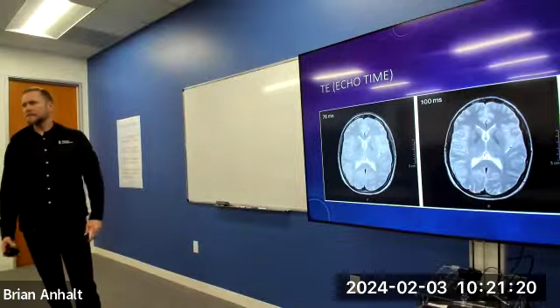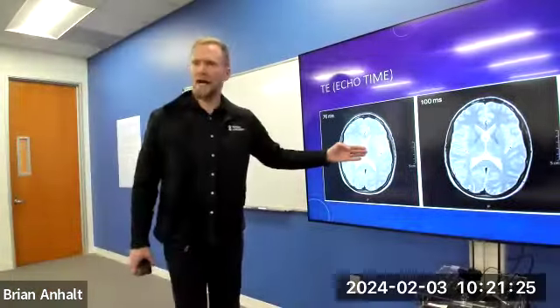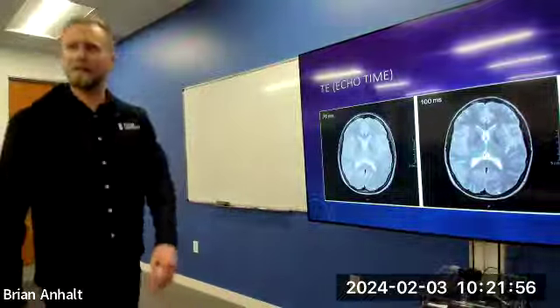Let's look at T2 weighted, right? You can see high SNR. Still high SNR, but what's getting better here? T2 contrast is getting better, right? And you can see here, a lot of contrast, but it's starting to look what? Grainy, right? We're losing SNR. This is a little bit outside of our T2 ranges. Depending on what body part we're looking at, this actually might be a good TE for T2. But in the brain, it's starting to get a little grainy, right?